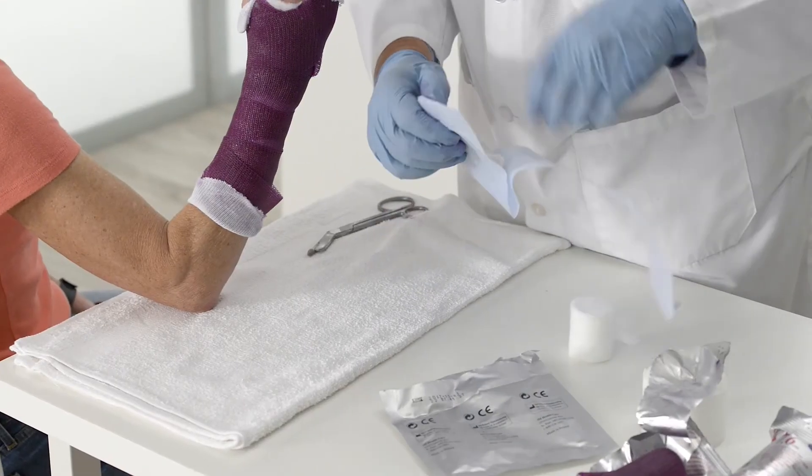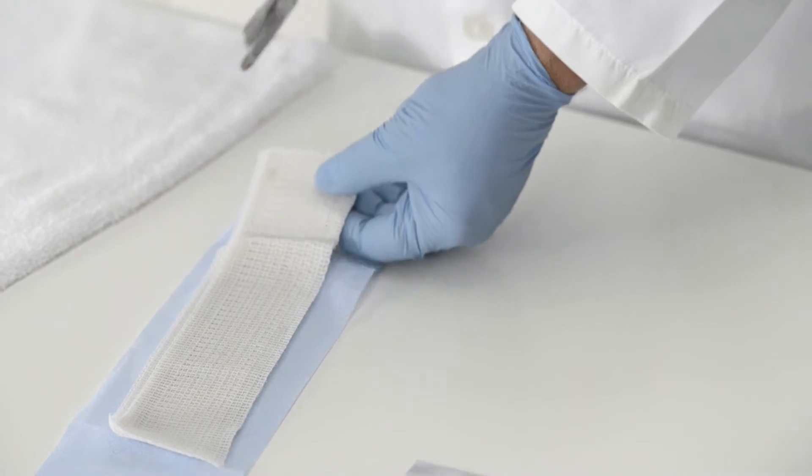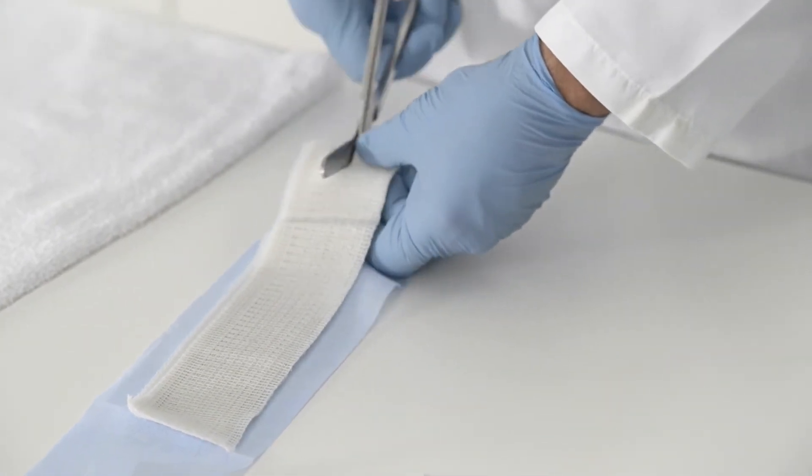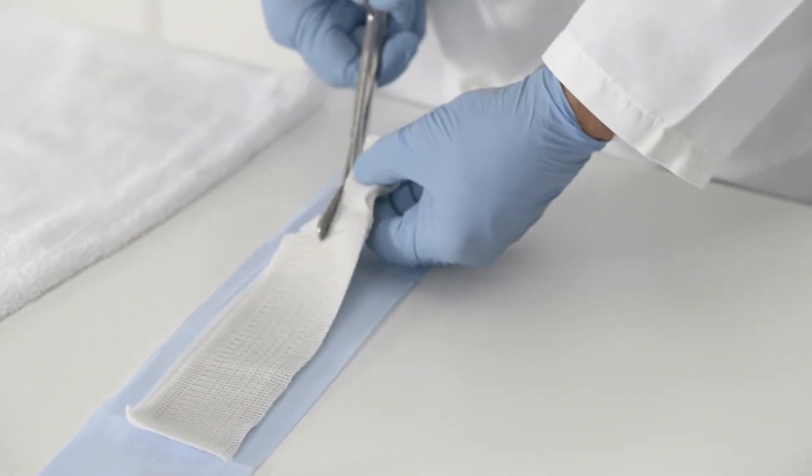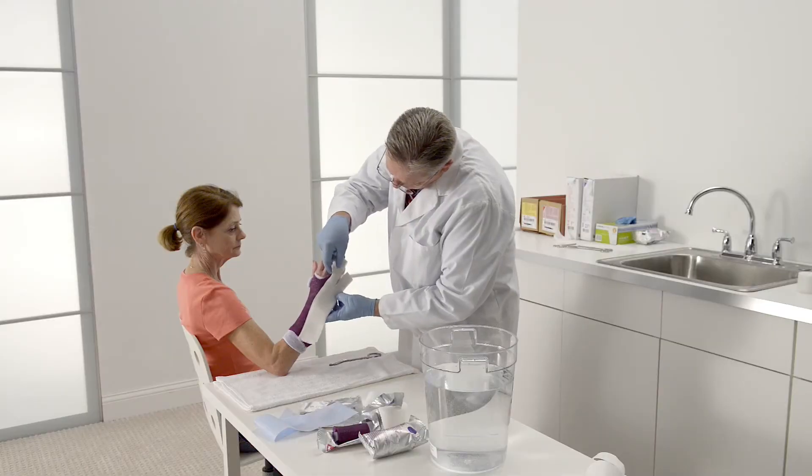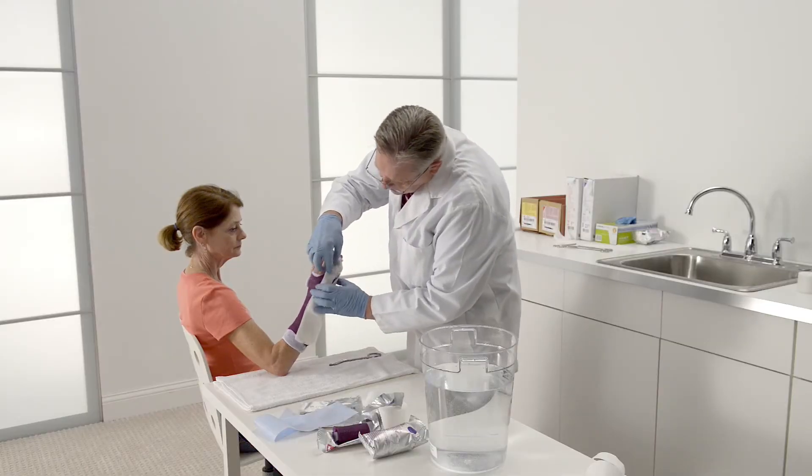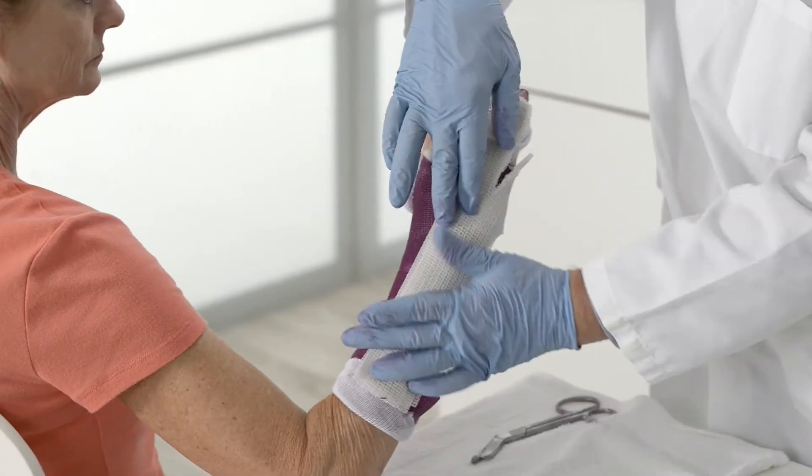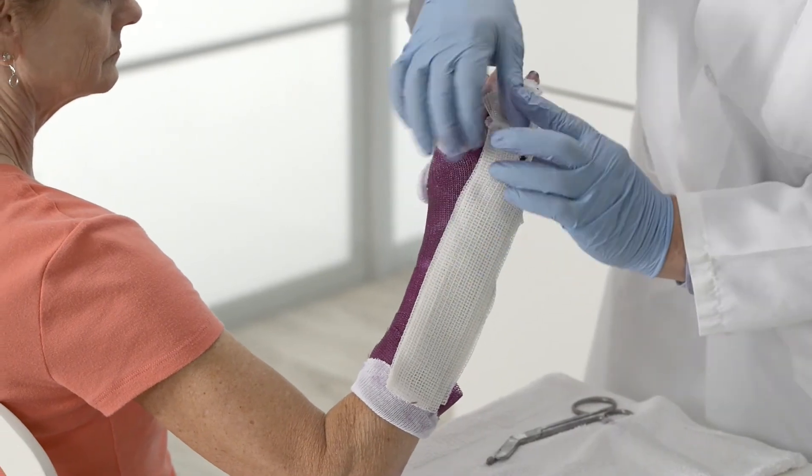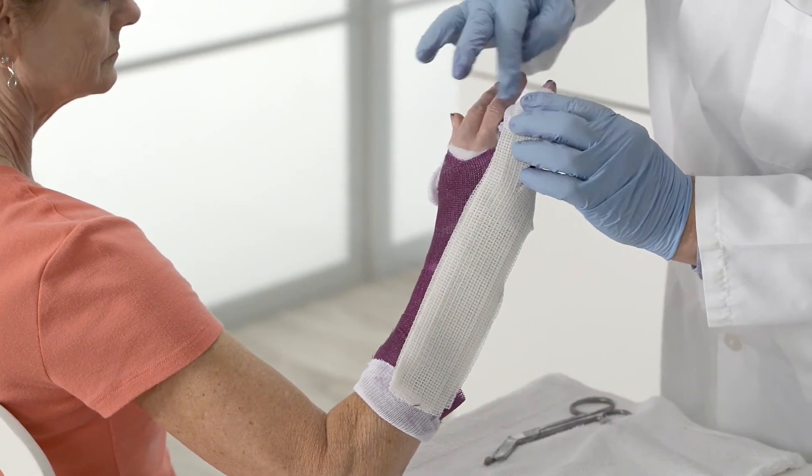We'll continue by applying the 3M PrimaCast unpadded splint. Cut a V at the top of the splint, and then wrap the V side of the splint around the affected fingers. Then wrap the long side of the splint around the ulnar side of the arm until it reaches just below the elbow.